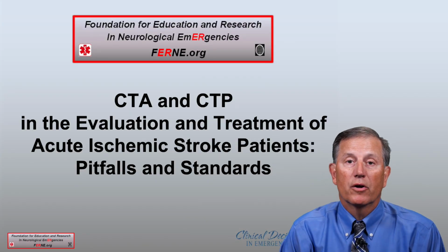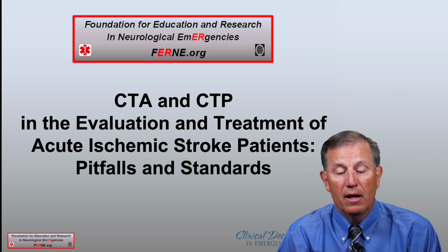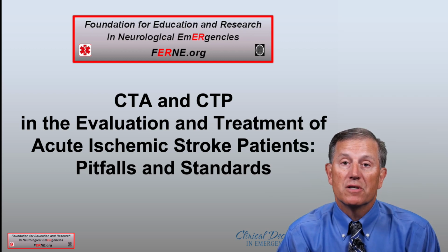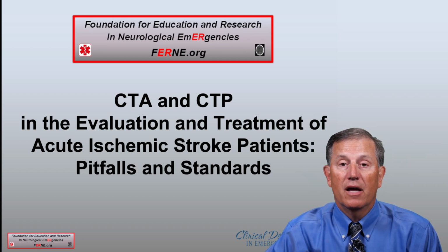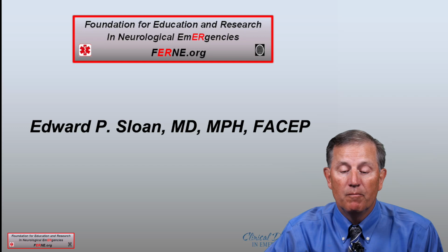Hello, today we are going to talk about the use of CT angiography and perfusion in the evaluation and treatment of acute ischemic stroke patients, addressing both standards and potential pitfalls. My name is Edward Sloan.